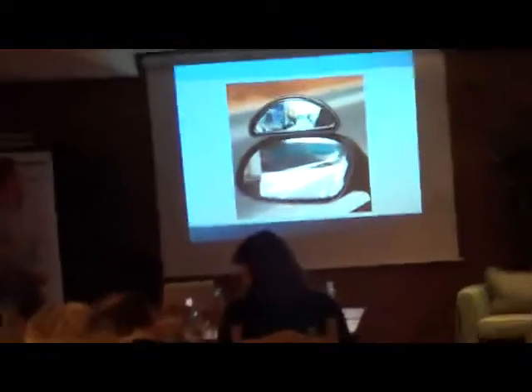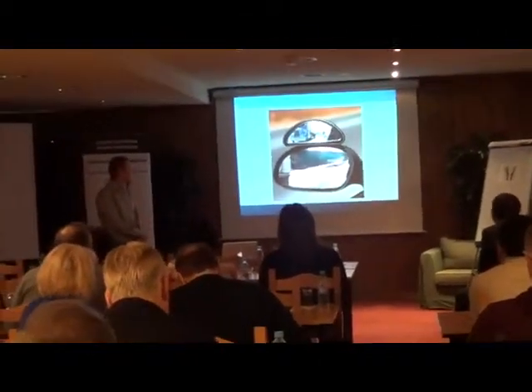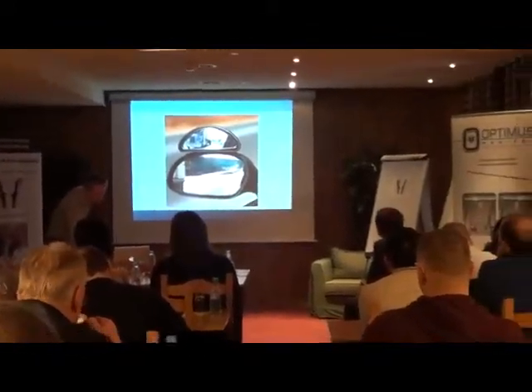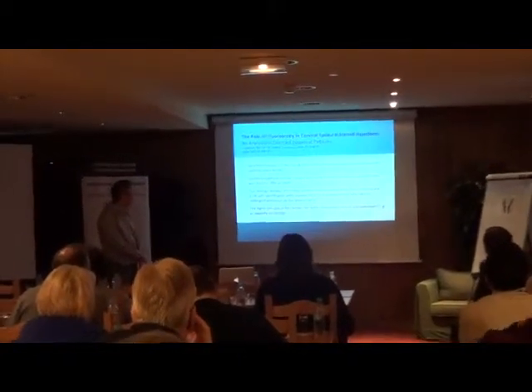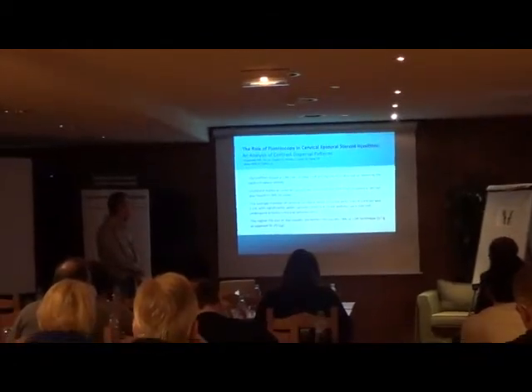This topic is about visualization. It's about knowledge. You definitely want to see this monster in your side mirror. So I picked up this article for some important issues. First, they found that there is a big chance that while performing this procedure blindly, you'll end up nowhere.